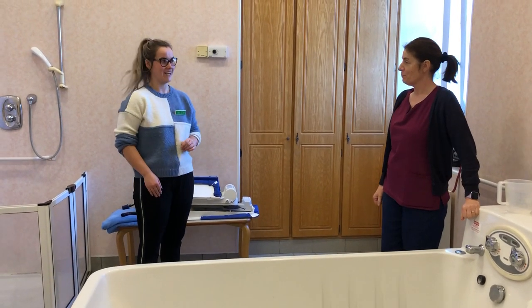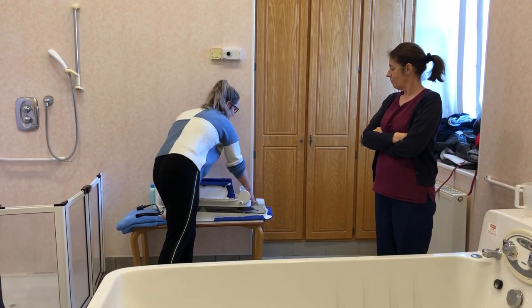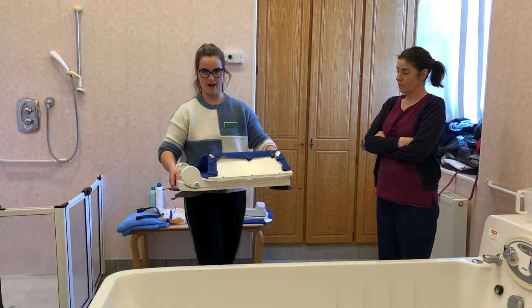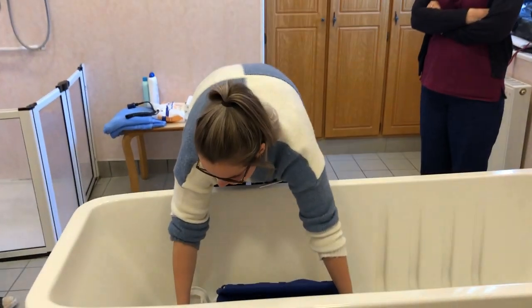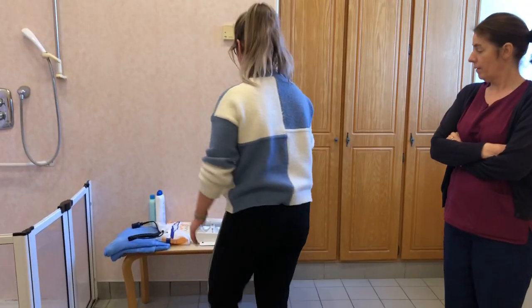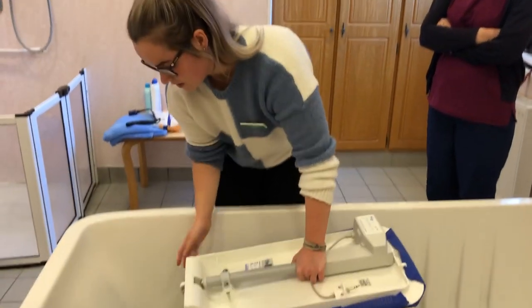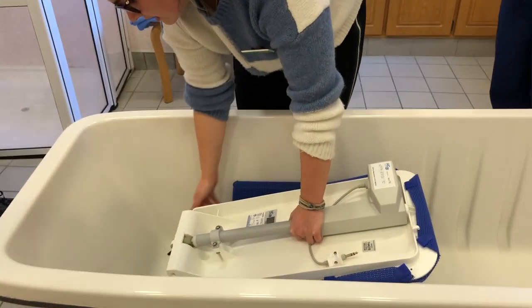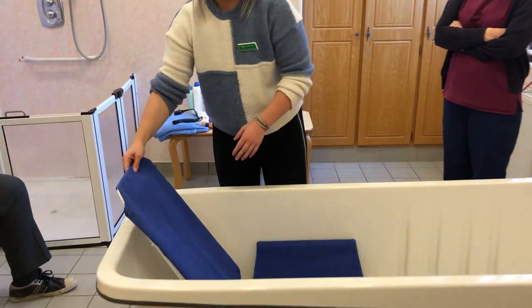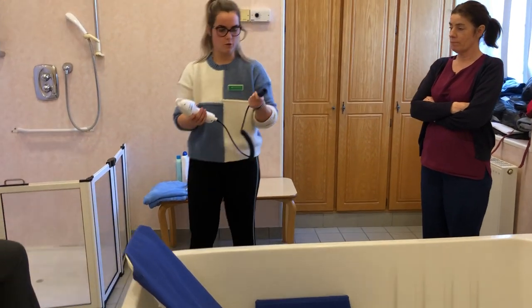In this video demonstration I'm going to show you how to use the powered bath aid. It comes in two different parts — this is the bottom part and you place that down into the bath like this, and that's the seat. Then this is the backrest and you slot these into the gaps here, and it should just lift up and recline back like that.